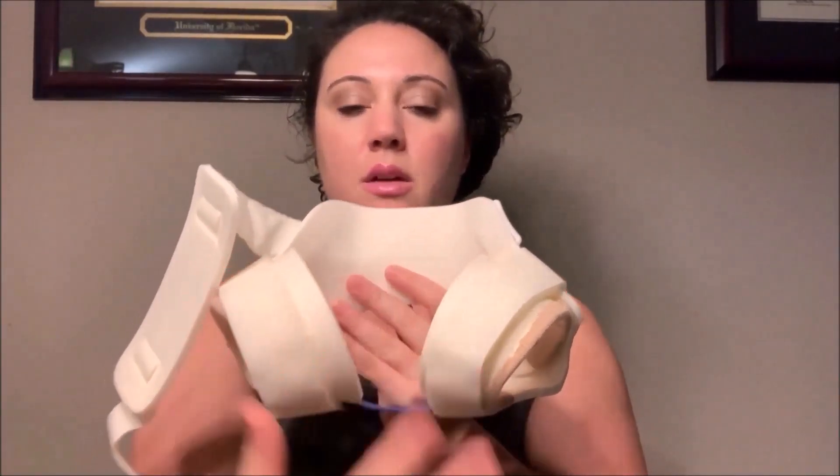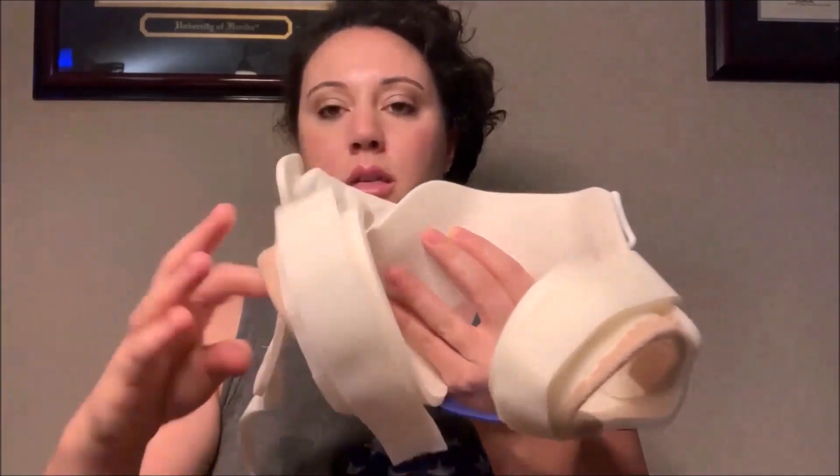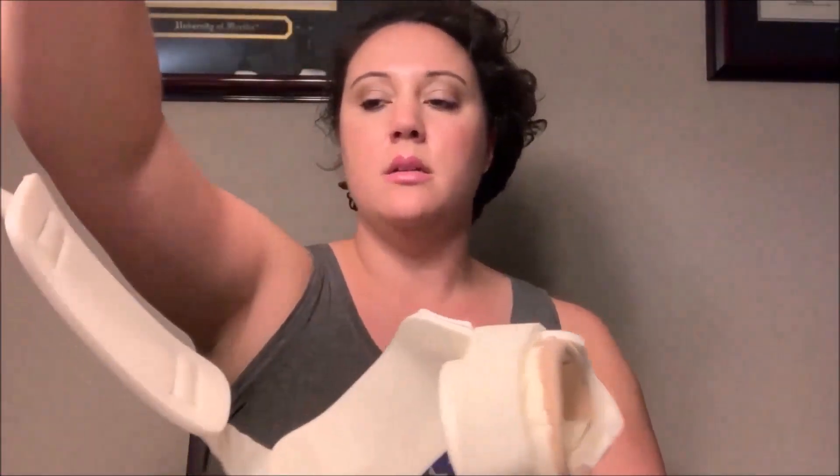Moving on to the hip brace — he was in this for about a month, starting June 2018. We talked in the first video about how his legs were in a frog position, and that's what this brace maintained. This piece here is all velcro and goes around his waist — this is the front, that's the back. His legs would go through here, and his bottom would sit right in this angled piece, with his legs then velcroed in.